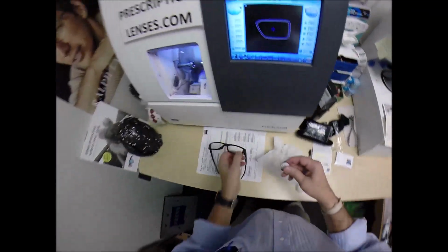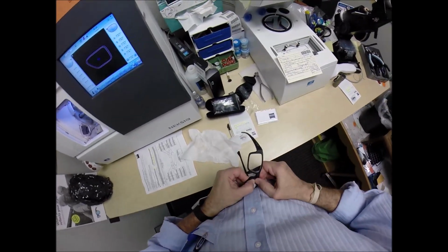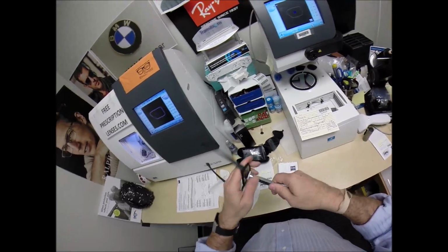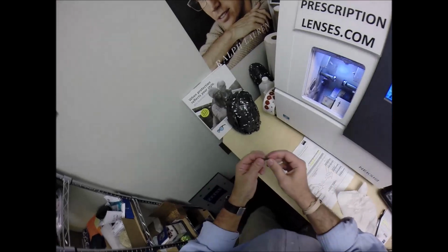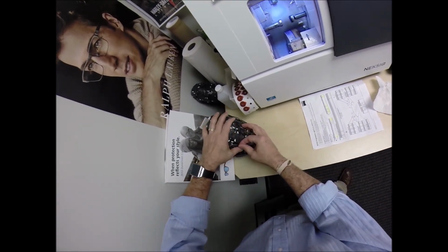All right, where'd your frame go? Here it is. All right, so let's tuck it in at the outside corner, press down at the nose. Now it snaps in there easily. Take this block off, pull the sticker away, dry that off, add to my sticker collection. Let's see if we can pin this down. I'm going to stick those two together, press that one on there.